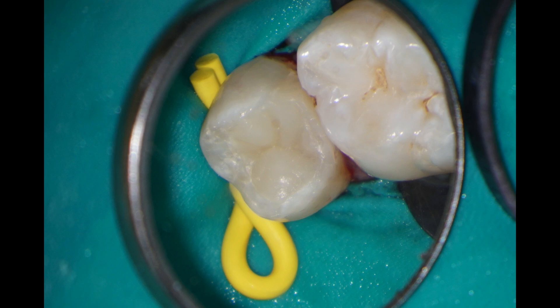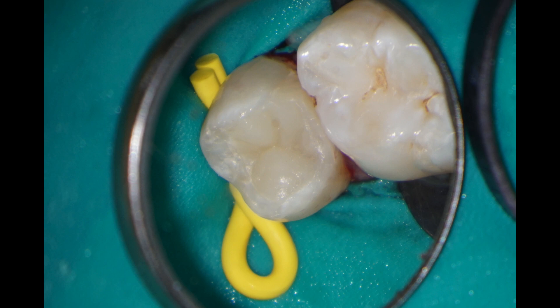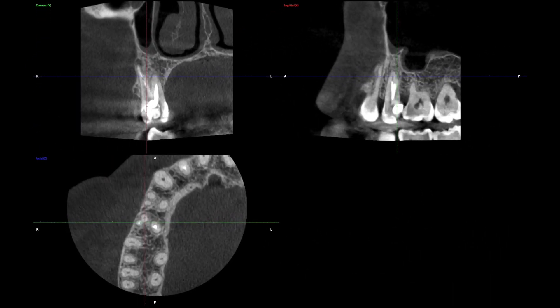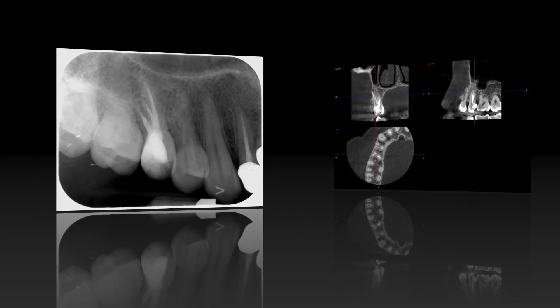Here you can see the final restoration before removal of the rubber dam. The pre-operative radiograph showed the poorly filled root canal system and CBCT which clearly showed the fractured file and the missed MB canal. The final result shows a good coronal-apical seal — the root canals are all filled and the adaptation of the composite restoration is good.